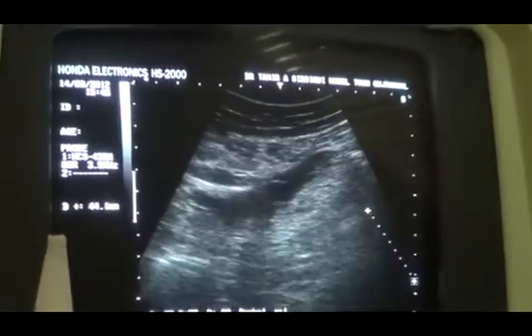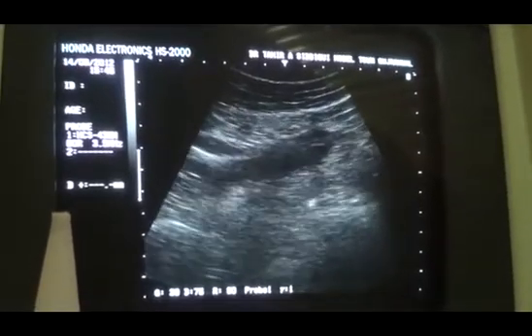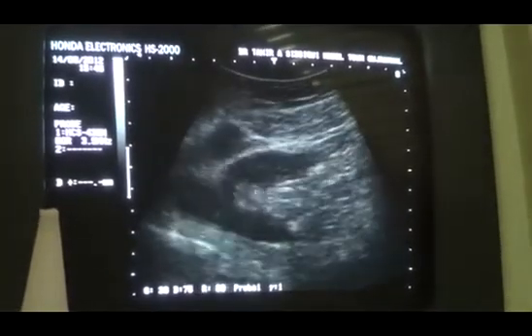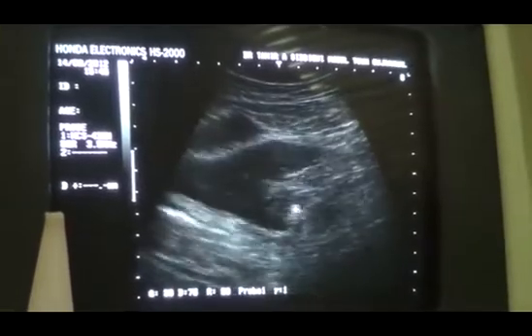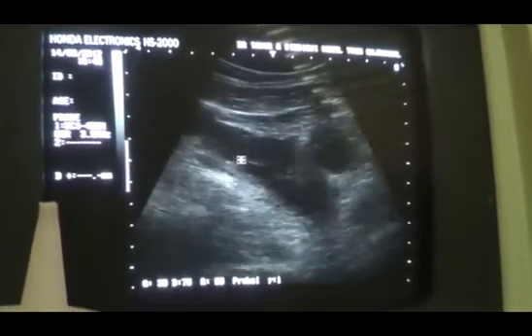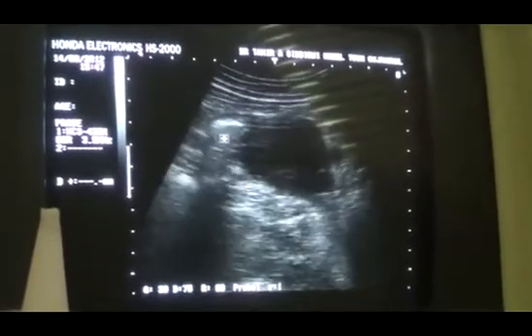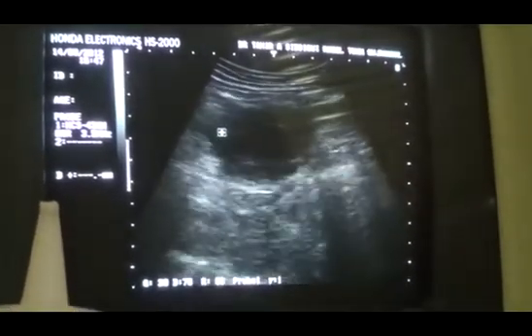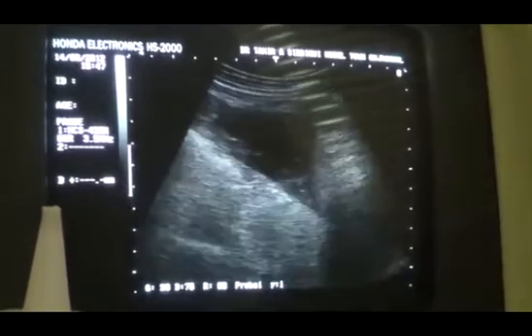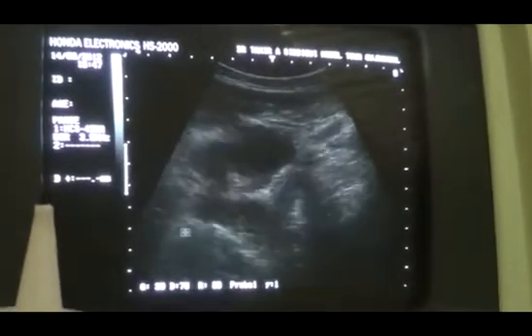Now this is the region of the left iliacus. This is the left paracolic gutter. This is the psoas muscle. Now follow this. Here it expands posterior to the urinary bladder, and now it is entering the right lower abdominal quadrant where the maximum expansion is seen. This is the right lower abdominal quadrant, and these are the right iliac vessels, and we do not see any lymph node in this region. So this is the story.